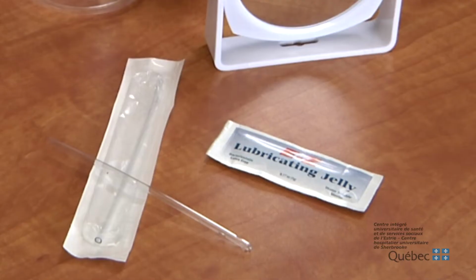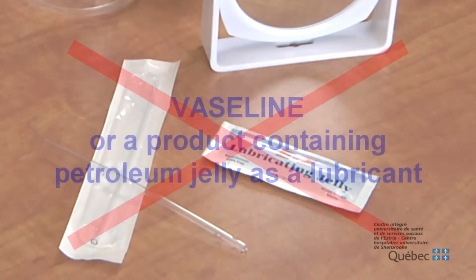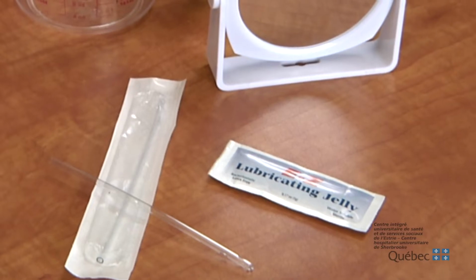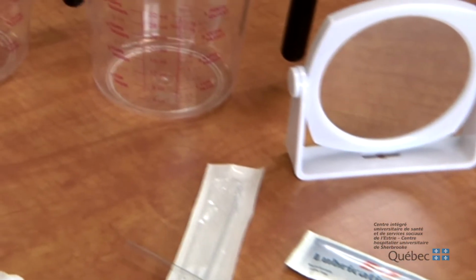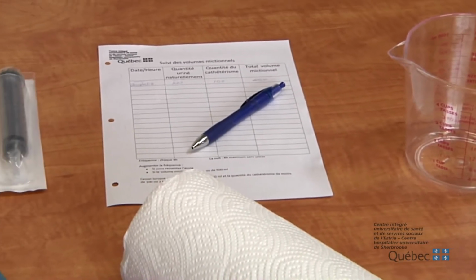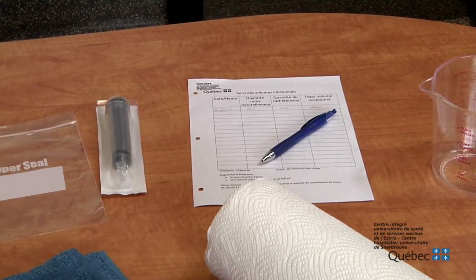Water-soluble lubricant in a packet or tube, such as KY or Muco. Be careful not to use Vaseline or a product containing petroleum jelly as a lubricant. Mirror. 2 measuring cups to collect urine. A pencil and sheet of paper, which will be given to you on the ward when you are discharged from the hospital. The sheet of paper is for recording the volume of urine collected during each catheterization.